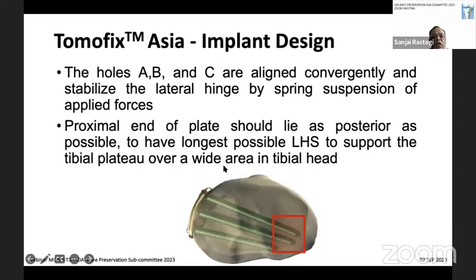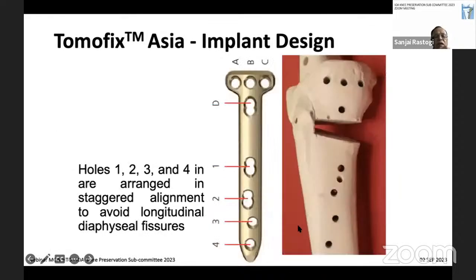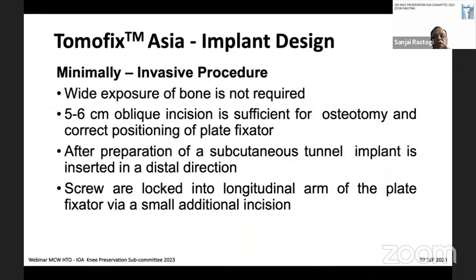The holes A, B, C are aligned convergently to increase the stability and have a spring suspension of the lateral hinge. And the proximal end of the plate should be placed as posterior as possible to have the largest possible locking head screws. The holes in the distal part are arranged staggeredly, so no vertical or shear fissure fracture takes place in the tibia.